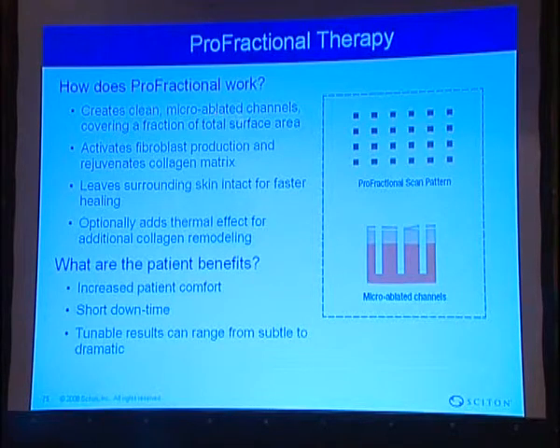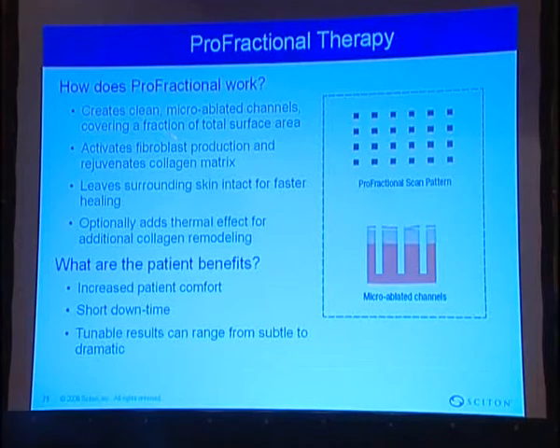It creates clean microablated channels covering a fraction of the total surface area, activates fibroblast production and rejuvenates the collagen matrix. It leaves surrounding skin intact for faster healing. Optionally, it adds a thermal effect for additional collagen remodeling. So if we are dealing with a case of wrinkles or acne scars, definitely we need some coagulation. But if you are dealing with very superficial pathology, just rejuvenation where the skin is in good condition, then we don't need the coagulation. So you have the option of selecting coagulation or no coagulation.